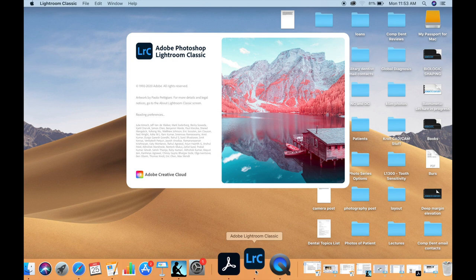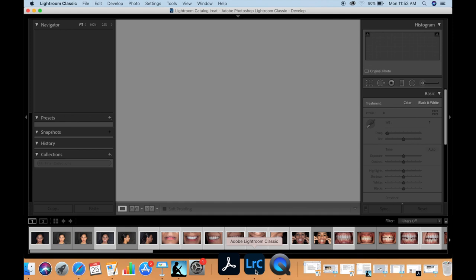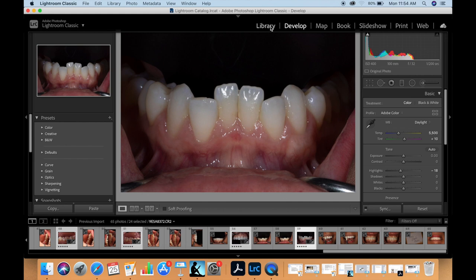Depending on whether you are a PC or a Mac user you will have various options available for editing. When editing dental photographs we are not really doctoring these photos up much — the majority of the editing involves changes to the exposure and cropping. As long as you have software that allows you to edit the exposure and crop, you should be fine. I personally use Adobe Lightroom, which can be obtained for as little as $9.99 per month and is compatible with PC and Mac.